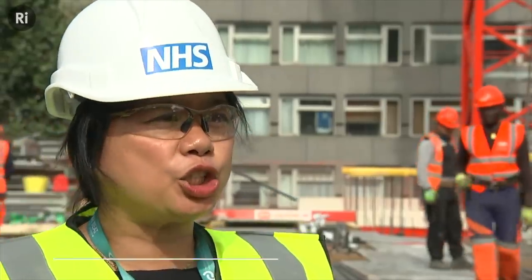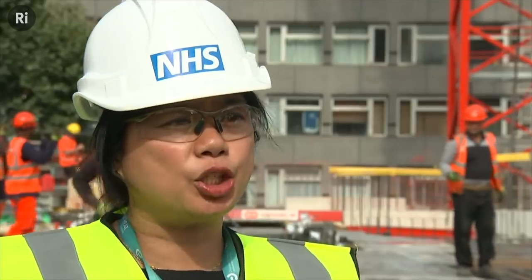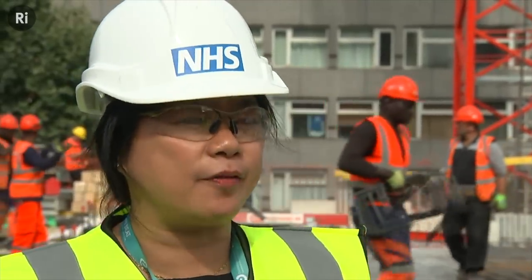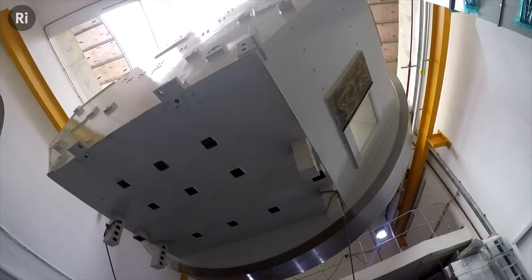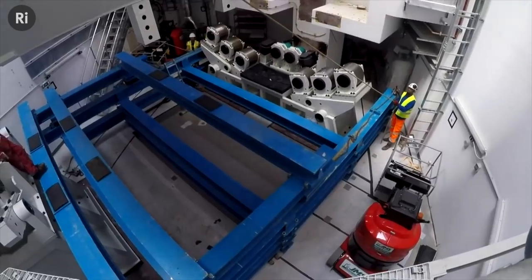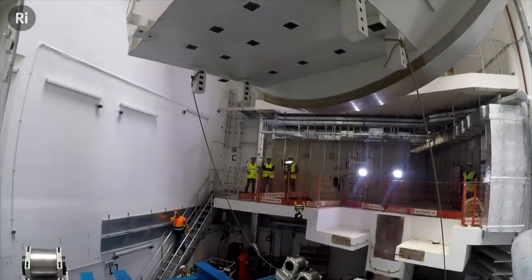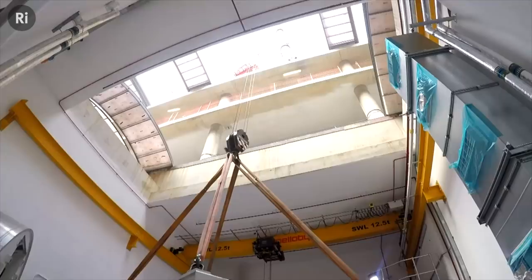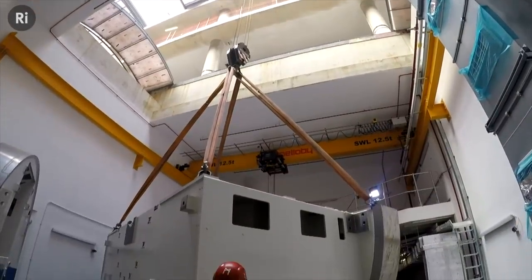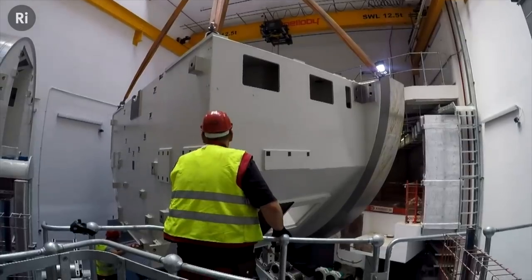Primarily, it's actually tumours in hard-to-reach places in children, teenagers, young adults, but also in some adults. So mainly brain tumours and tumours that are in and around the spine and pelvis. Though even these predominantly young cancer sufferers only represent 1% of all radiotherapy patients. It was this proton beam therapy that 5-year-old Asher King's parents fought so hard to get, eventually in Prague in 2014. His story catapulted the treatment into public consciousness.